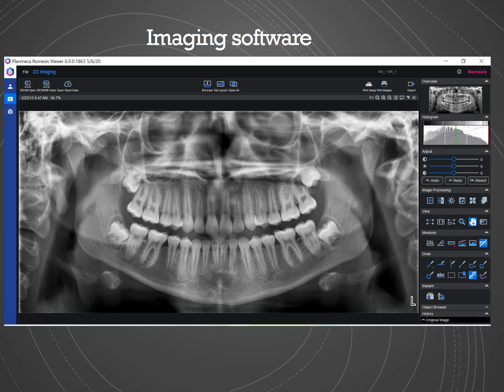So, with the latest advancements in imaging software, panoramic radiographs can be really interesting, and you have various fun tools that can be used. But essentially, for diagnostic purpose, you rarely use most of the tools, but you do use them for patient education. They can be very useful in making the patient understand where the lesion is, or where the pathology is, or which tooth we are going to extract, or what the measurements of a particular area are where the implant is going to be placed. So all in all, the imaging software has a very interesting interface, and it allows you to make adjustments to brightness, contrast, etc., as well as viewing it in different measurements and planes, giving you an ideal method of imaging and a very impressive patient education platform.